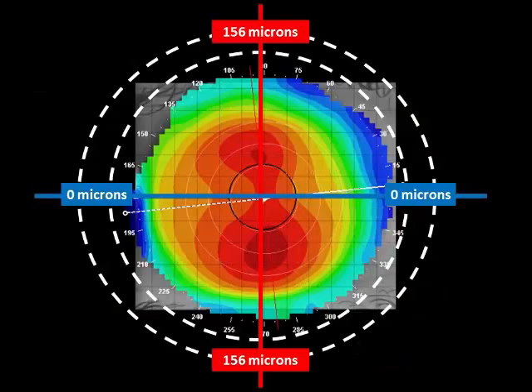So, for instance, in a study at Pacific University, we looked at the average amount of depth differential between the horizontal and the vertical meridian. If our scleral lenses, for the most part, hit down at 3 and 9 o'clock, how much would they lift at 12 and 6 o'clock? And the surface of the conj is about 150 microns deeper across the vertical meridian.